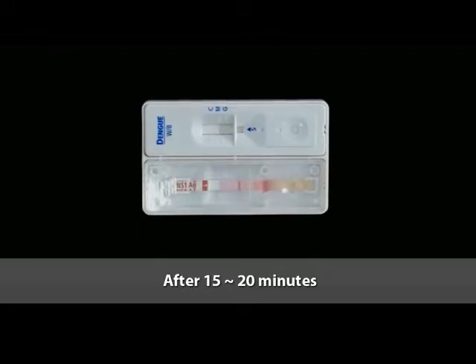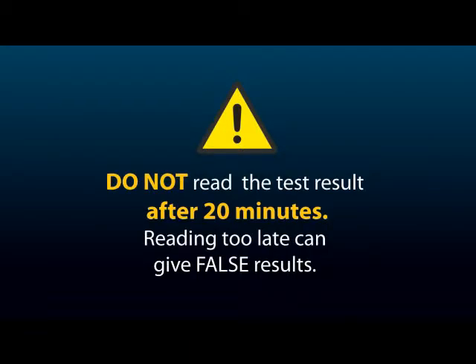As the test begins to work, you will see purple color move across the result window in the center of the test device. Interpret test results after 15 to 20 minutes. Do not read test results after 20 minutes. Reading too late can give false results.